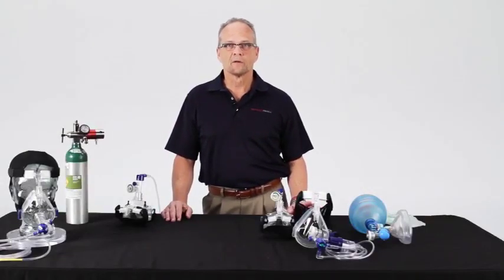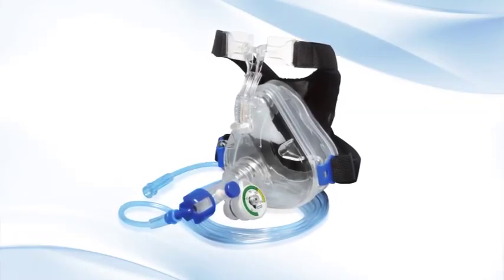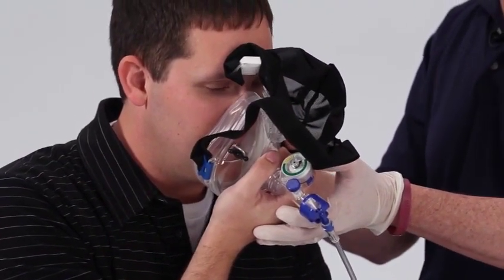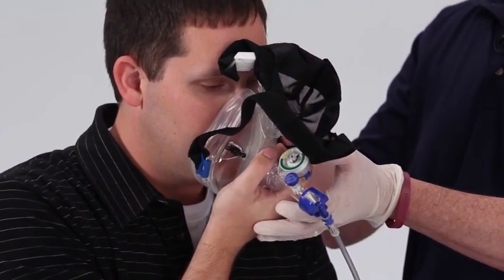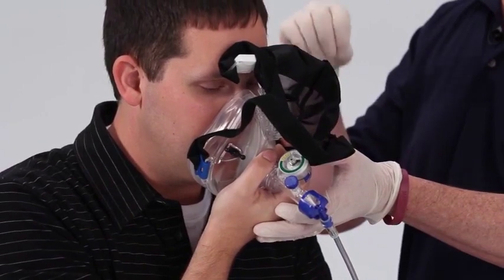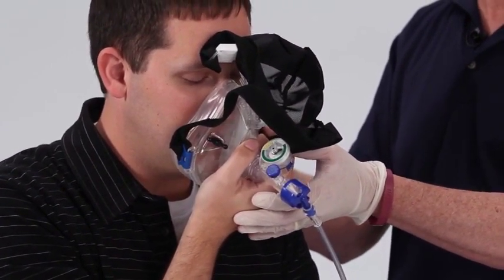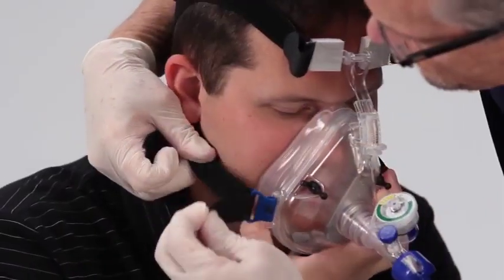With the deluxe mask, I find it's best to pull the head harness back over the mask, allowing the patient to hold the mask to their face without the harness on. This is when coaching is at its premium. Keep a hand on the mask, allow the patient's hand to pull the mask away in the beginning, and slowly use your hand to hold the mask in place. Once they allow you to keep the mask on, pull the harness over their head and tighten the Velcro.